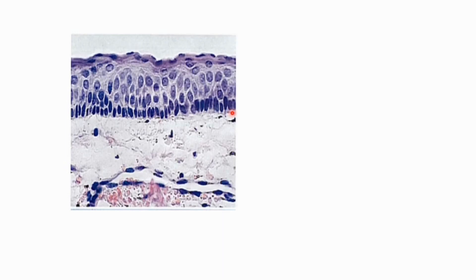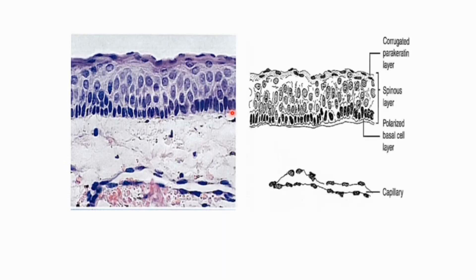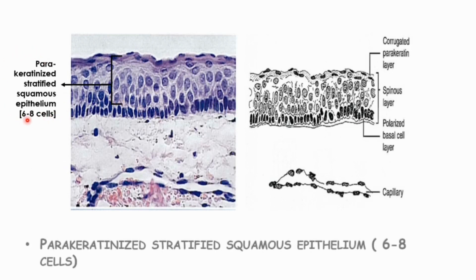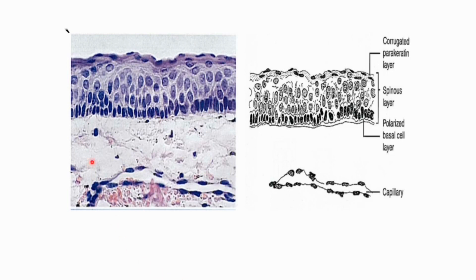Histopathology of odontogenic keratocyst. The microscopical view shows parakeratinized stratified squamous epithelium which is 6 to 8 cells in thickness. It exhibits a wavy or corrugated appearance because of the presence of parakeratotic cells.